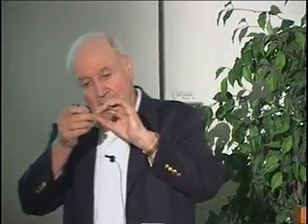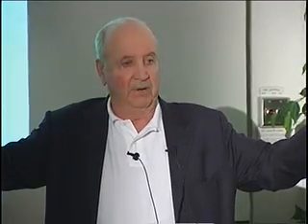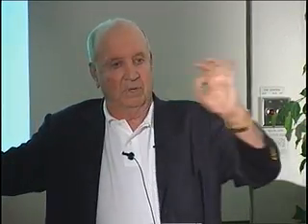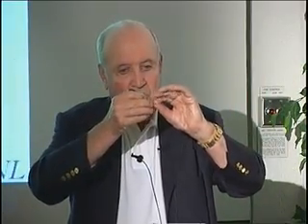So these little bombs going off, two of these gamma rays coming out, if you know when this arrived here versus when it arrived there, you can locate where the event was along the line. So you know where the line is because you've got a whole array of crystals around, and then you know where along the line it is. Perfect. You don't know exactly where, only within a few centimeters, but that's better than not knowing where it is at all along the line.